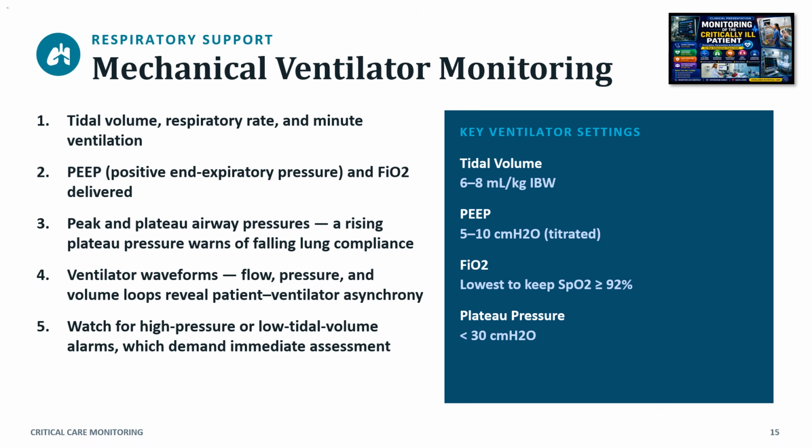Keeps alveoli open and improves oxygenation while avoiding overdistension. FiO2, lowest to keep SpO₂ greater than or equal to 92%. Prevents hypoxia while minimizing oxygen toxicity. Plateau pressure, less than 30 cm H2O. Target to reduce risk of barotrauma and lung injury.